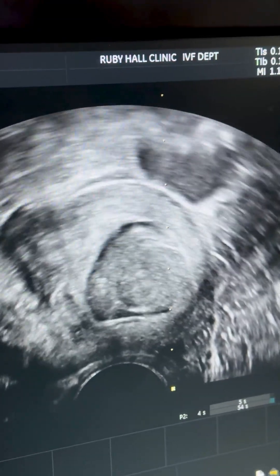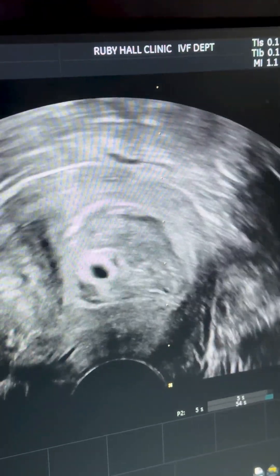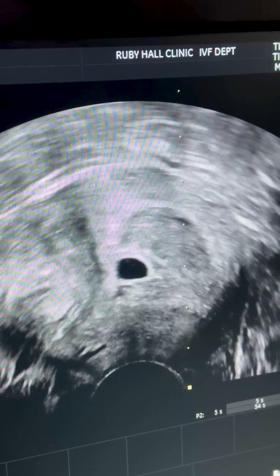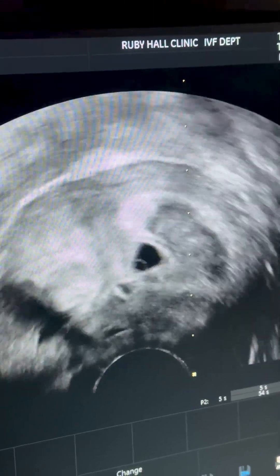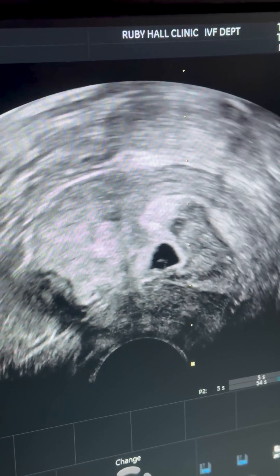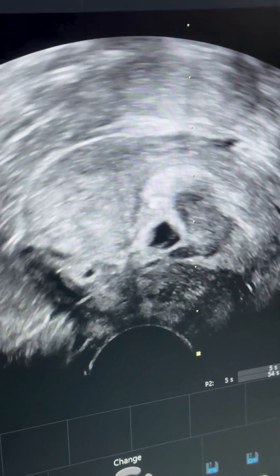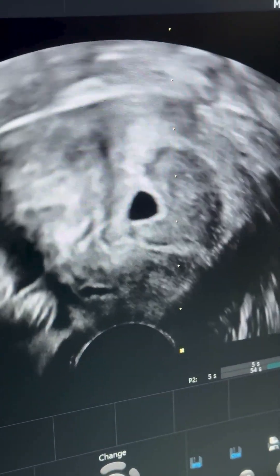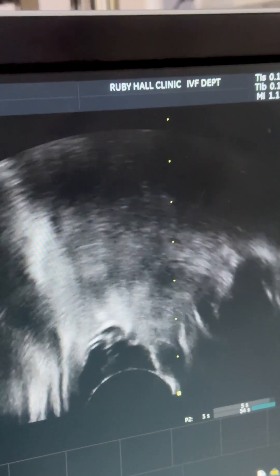The cavity is full of blood clot and the sac is inside that blood clot. It's not possible. You can see there is a yolk sac here — early fetal pole. I would have saved this pregnancy, but unfortunately it is not possible. Thank you.